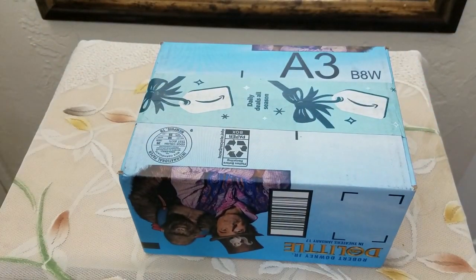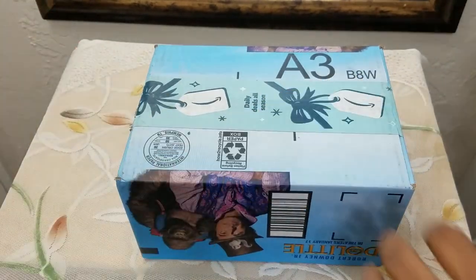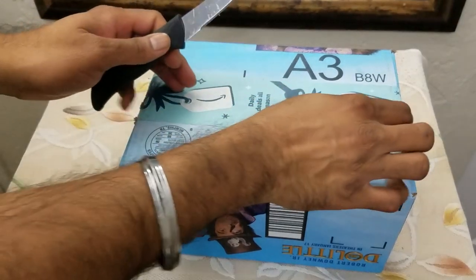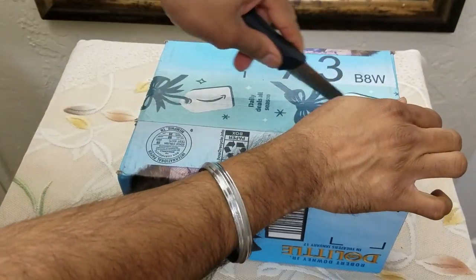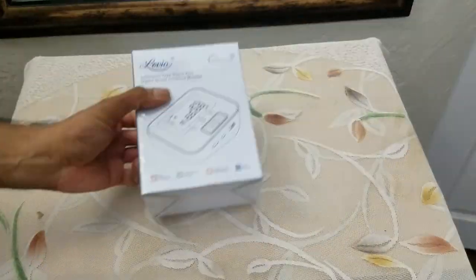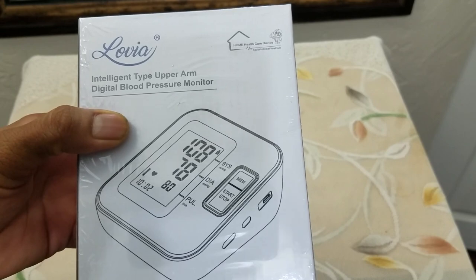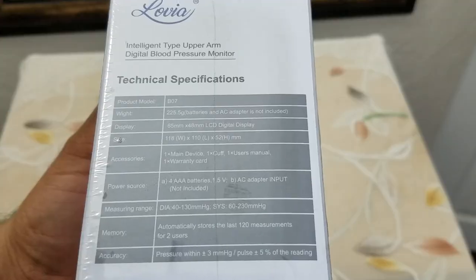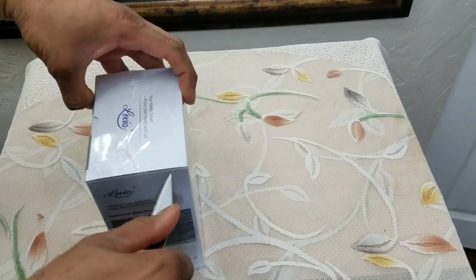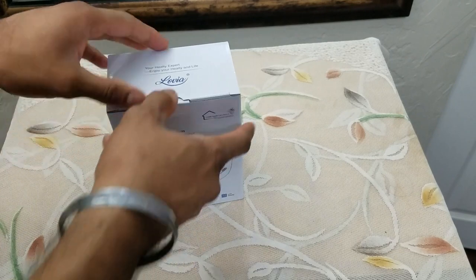What's up people, coming to you with a video. This time we're going to be unboxing and reviewing another item — an intelligent type upper arm digital blood pressure monitor. This is the product UPC code and these are the product specifications. Without further ado, let's open the package.